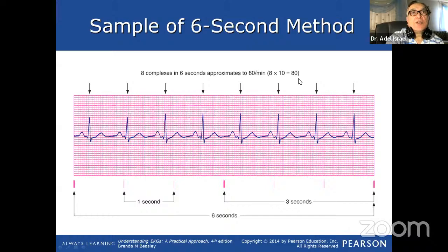You remember? So 75 is not accurate 100%. Why? Because it is actually not fully 4 boxes. So if I need to make it more accurate, let us count together the small boxes. Pay attention with me. 1, 2, 3, 4, 5, 6, 7, 8, 9, 10, 11, 12, 13, 14, 15, 16, 17, 18, 19, 20, 21, 22, 23.